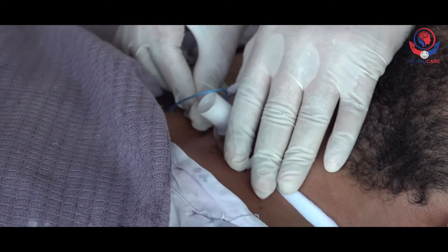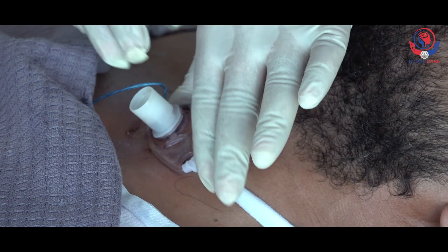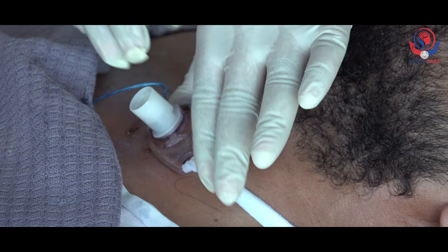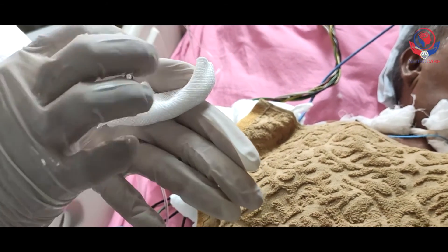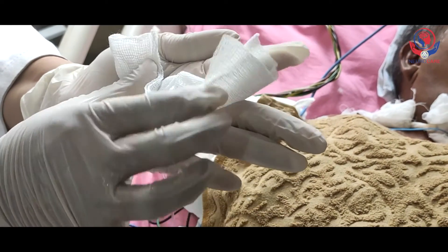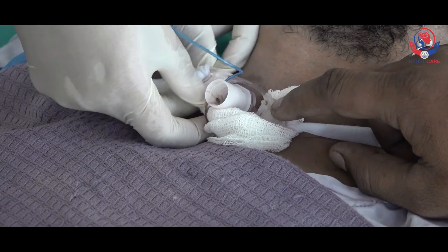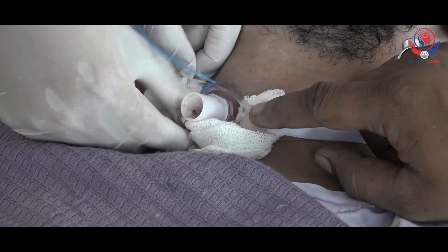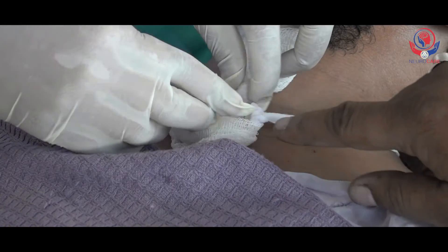Clean the visible area of the tracheostomy tube in the same manner. Dry the area thoroughly using gauze pieces. To avoid dislodgement of the tube, secure it with your thumb and fingers of the non-dominant hand, or take another person's help. Now take a rectangular gauze piece dressing and apply the sterile gauze piece dressing around the tracheostomy tube while another person holds the tube in place.